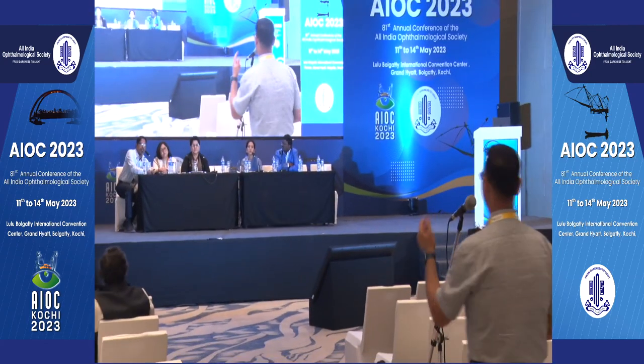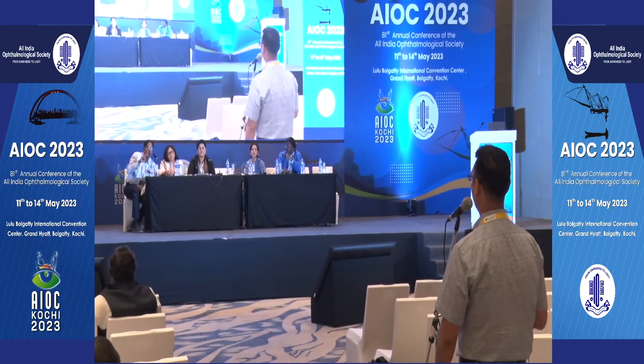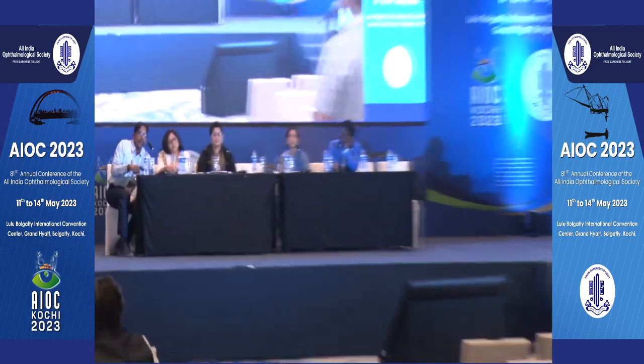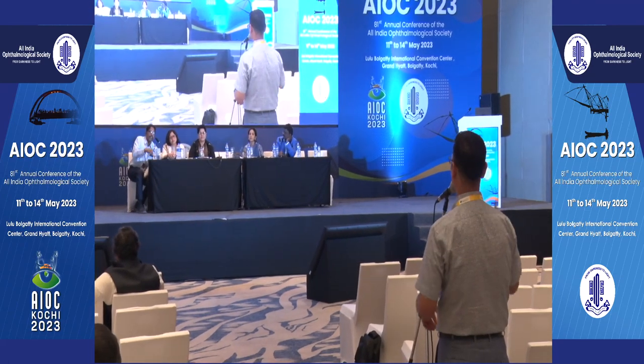What difficulty do you find while removing this kind of silicone oil? Like when the PVD is not complete, the view may be... No, this is just an adjunct. We don't keep the oil. We removed it immediately. In the second case, I removed the oil after removing the foreign body. Okay, so do you find any difficulty in that, or just by active suction you... No, because they have a large wound. Once you switch on the infusion, the oil will come out in 10 seconds.